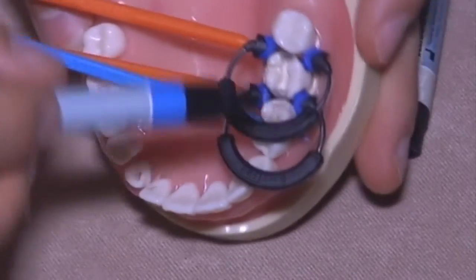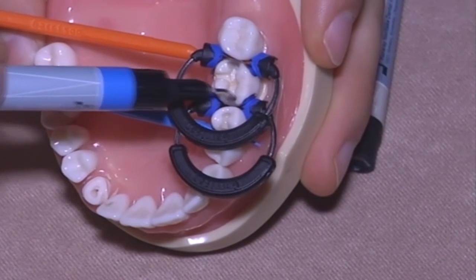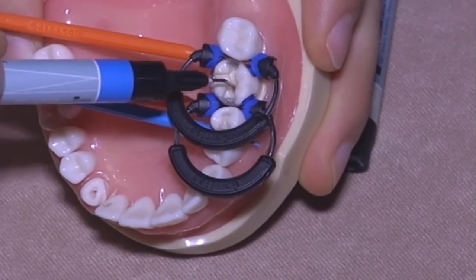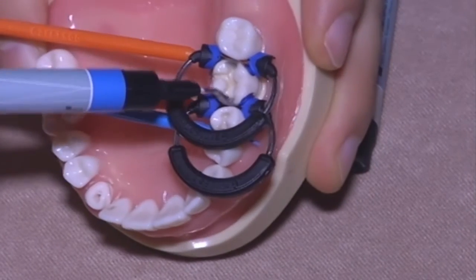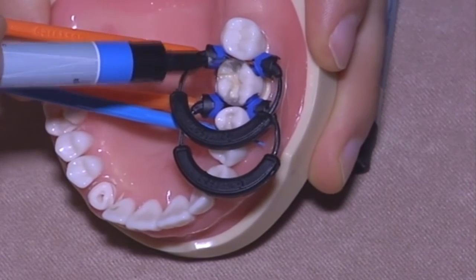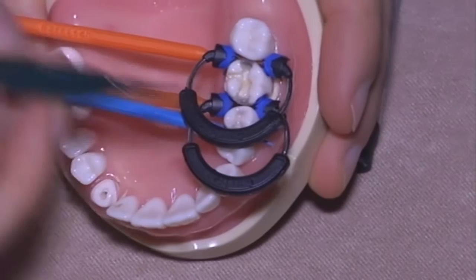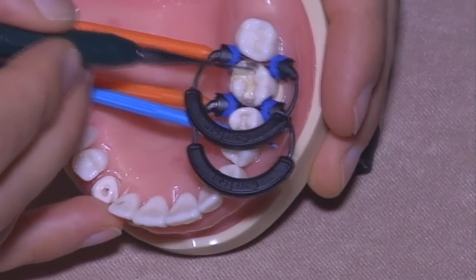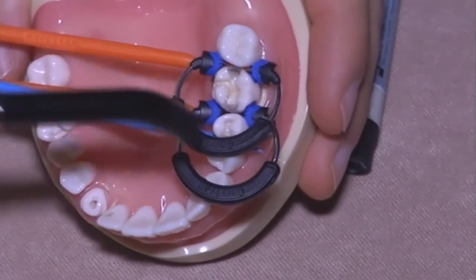Again, flowable composite along the wall cavity everywhere. A small quantity of flowable. Light cure.